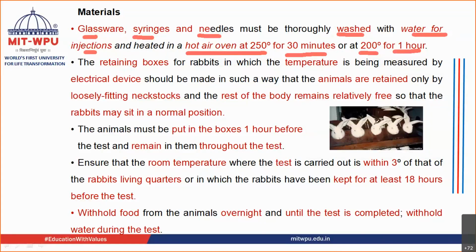The animal should be contained in a loosely fitted neck stock, and the rest of the body, the behind, should remain relatively free, so that the animal can sit comfortably in the normal position.